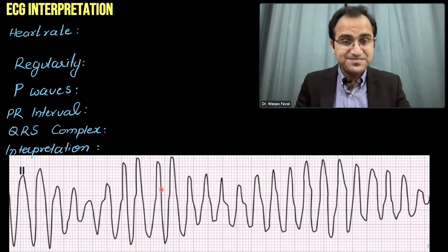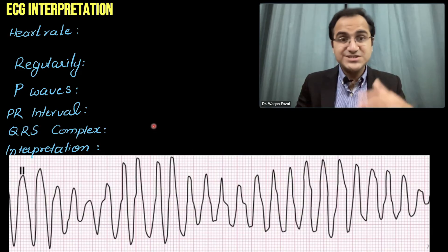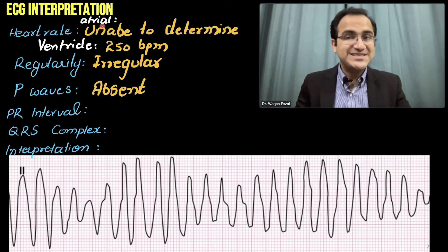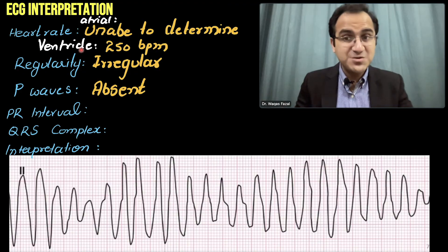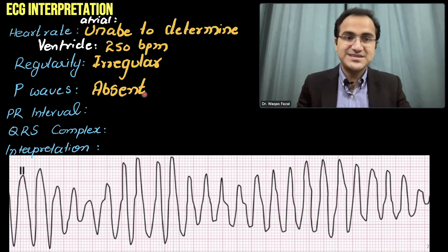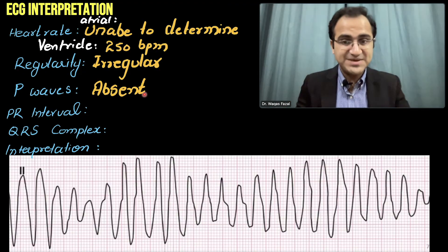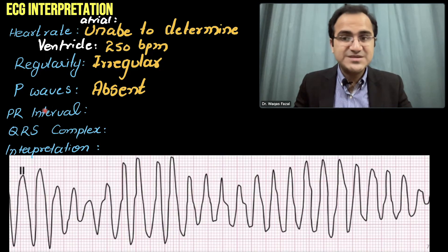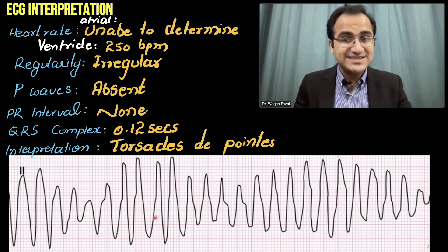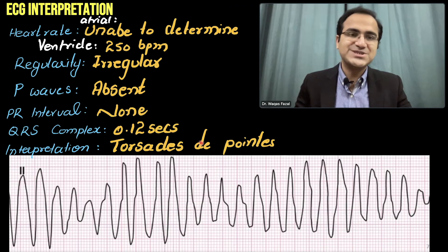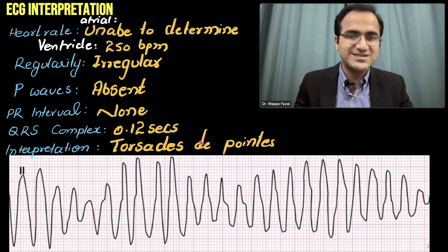This is another ECG of torsades — these are the pointed ends and these are the round ends. The atrial rate is unable to be determined as there are no P waves. The ventricular rate is 250 beats per minute, calculated by the six-second method. P waves are absent, PR interval is none, QRS complex is wide, and the interpretation is torsades de pointes.